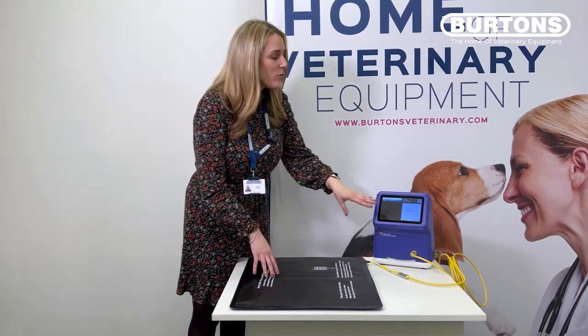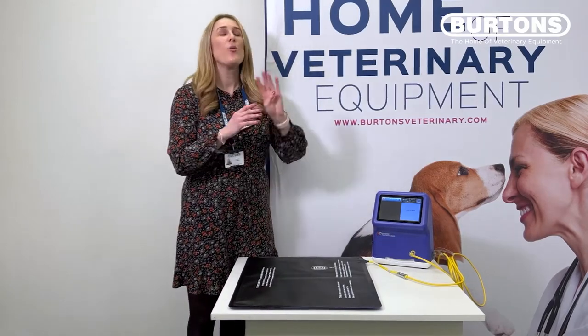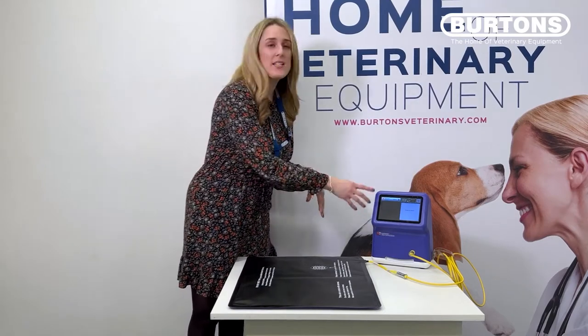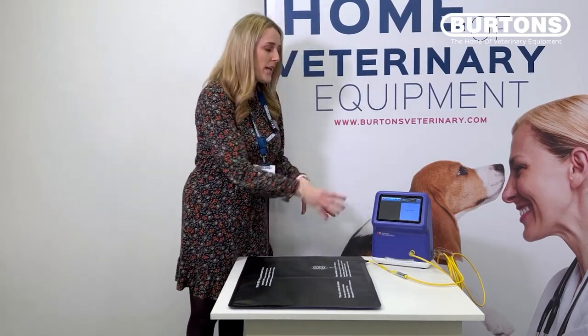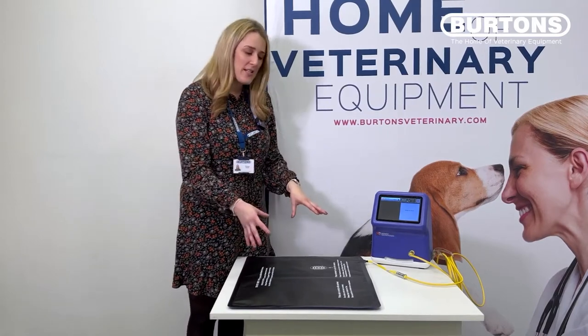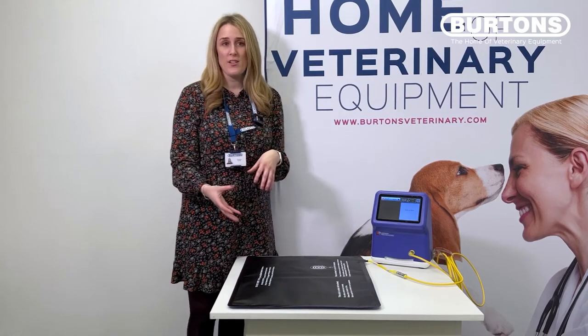Conveniently, it comes with a really long four-metre cord, so you can keep the patient controller quite a distance from your patient's kennel. As soon as you plug in the unit and select your desired temperature, it will reach that temperature within three minutes. You can set the temperature range on these mats from 37 degrees up to 43 degrees.